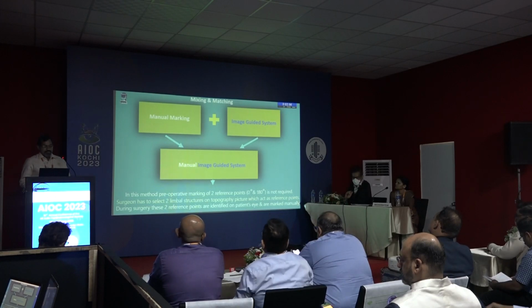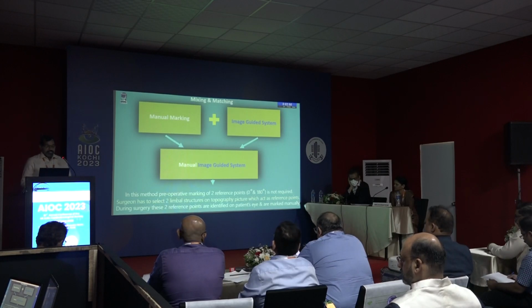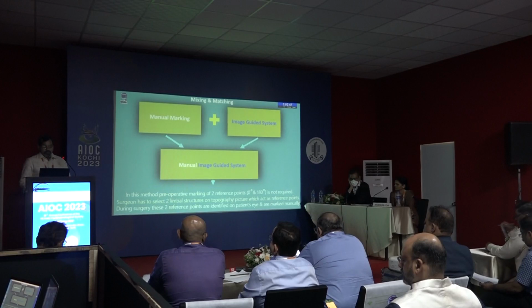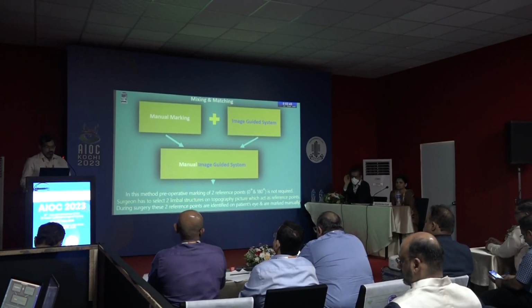In this method, preoperative marking of the 2 reference points, 0 and 180 degrees, is not required. So there are no preoperative markings. The surgeon has to select 2 limbal structures on the topography picture, which are prominent, and they act as the reference points.